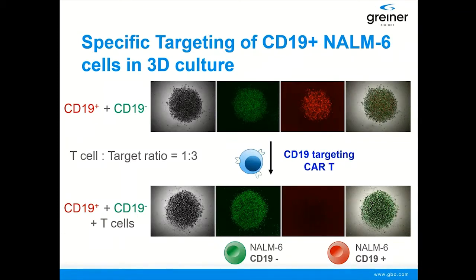And that means that the cells are blood cells, and they don't form 3D structures. They're circulating cells. So why are we using 3D cell culture with a cell that doesn't generate 3D structures? We're using the magnetic 3D cell cultures to make it easier to manipulate the cells.